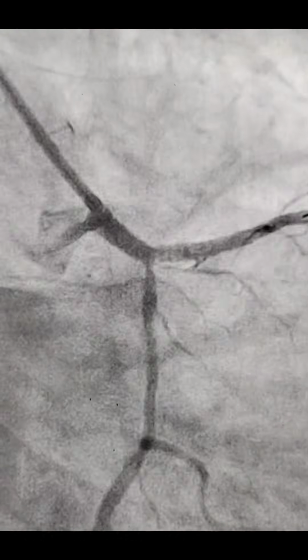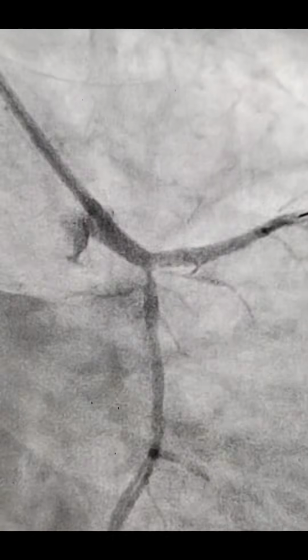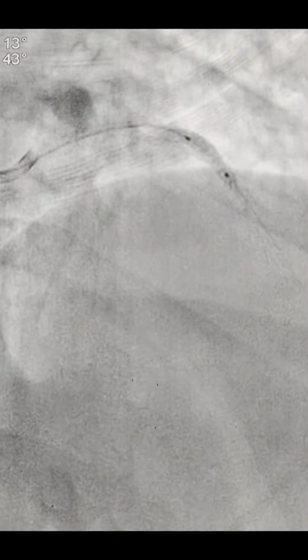LCX got pinched. So now the strategy was to open this stent strut in the LCX. So we did the NC for this earlier stent, and in proximal LAD also, with the 2.5 balloon. Then after POT and NC, we took an IVUS shoot, and we confirmed that there was no underexpansion, no edge dissection, nothing. It was wonderfully expanded, both stent in the LM and LAD.